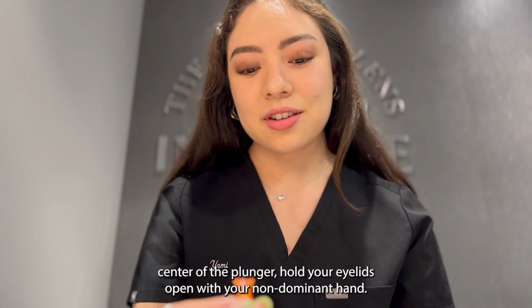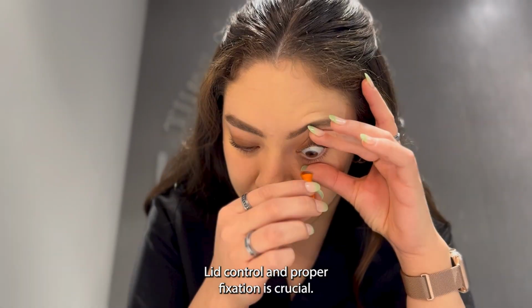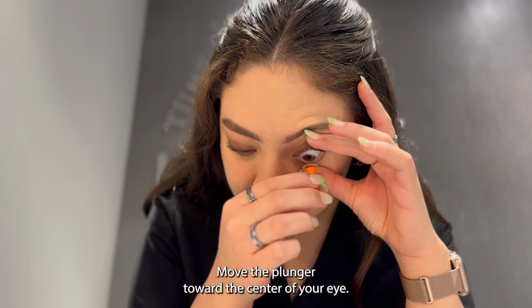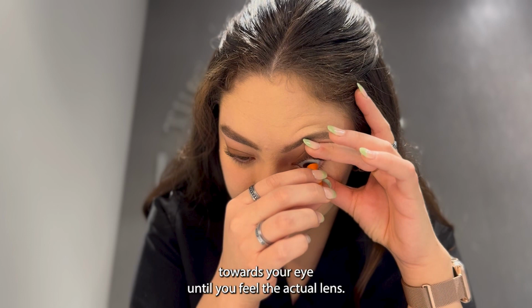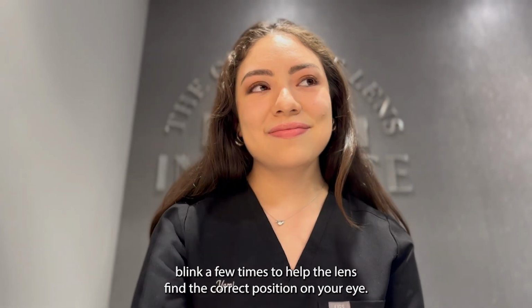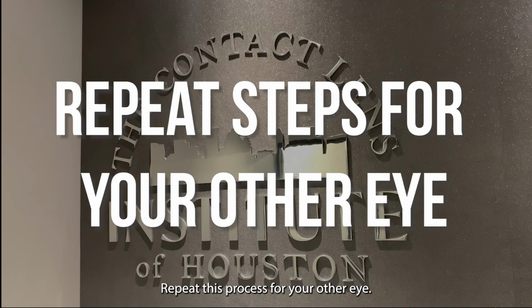Looking straight down at the center of the plunger, hold your eyelids open with your non-dominant hand. Lid control and proper fixation is crucial. Move the plunger toward the center of your eye. You will feel the fluid in the lens first, but keep moving the plunger towards your eye until you feel the actual lens. When you feel the lens touch your eye, release your lids. Blink a few times to help the lens find the correct position on your eye. Repeat this process for your other eye.